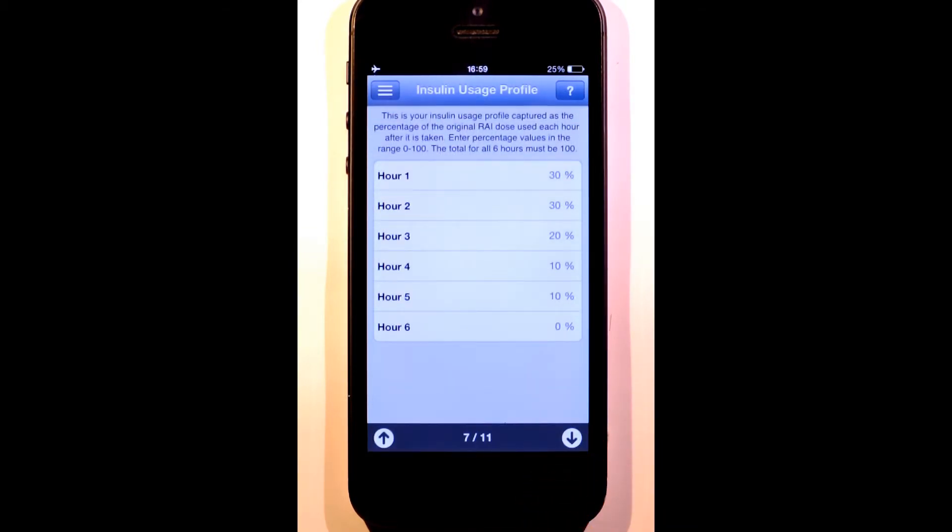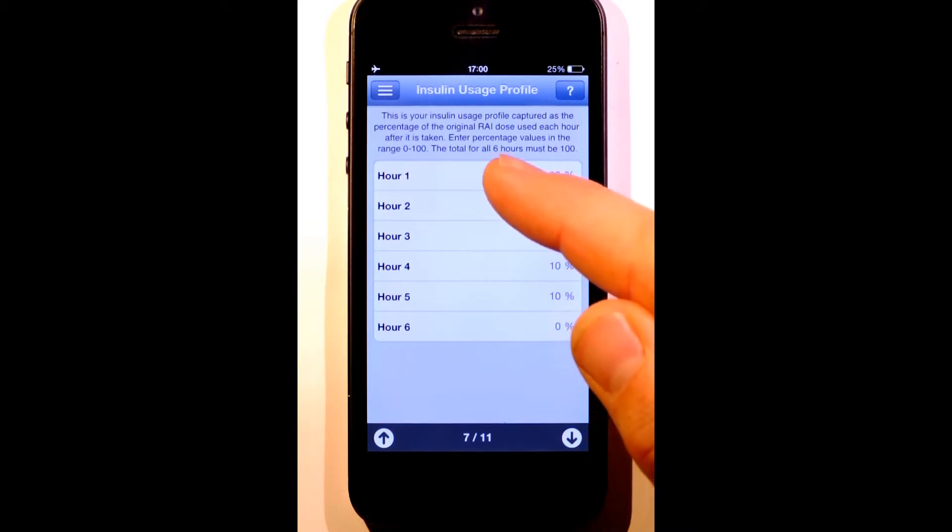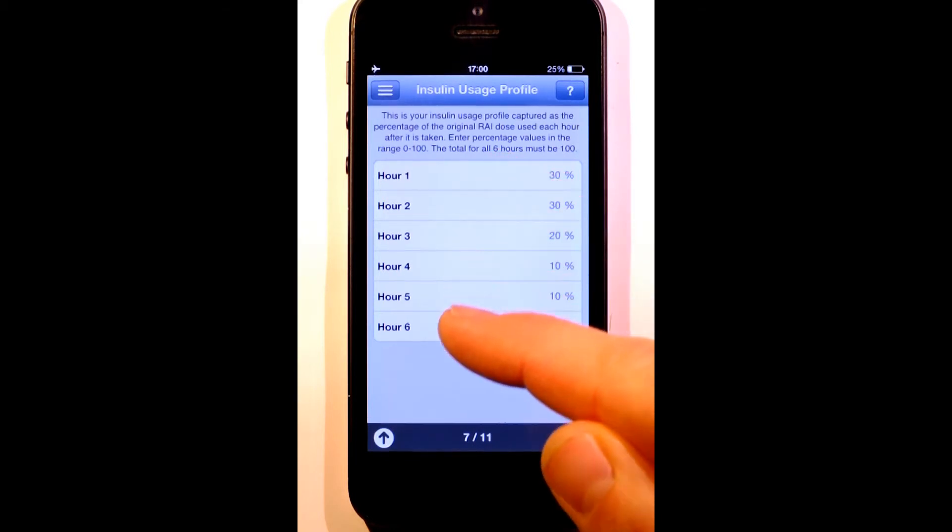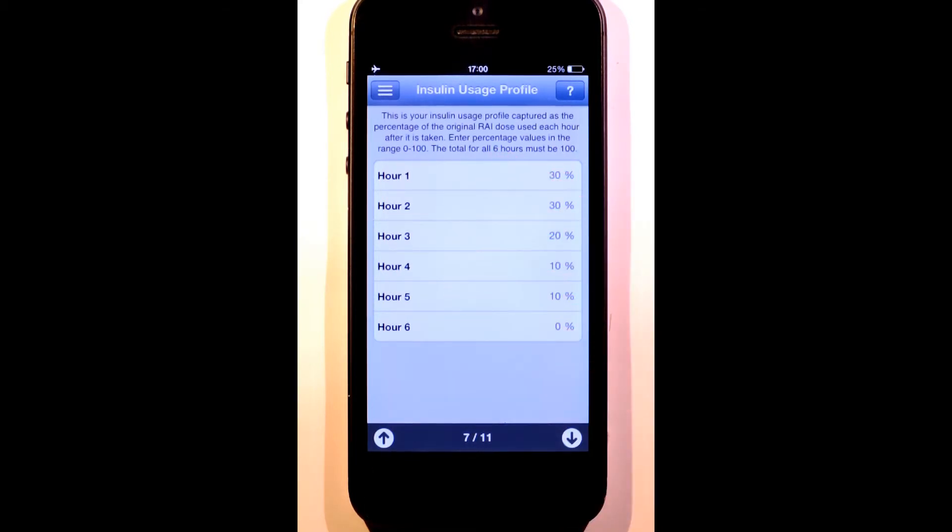The insulin usage profile is used by RapidCalc to work out how much insulin is still active in your system at any given point in time, commonly referred to as insulin on board. These 6 hours represent the 6 hours following a dose.